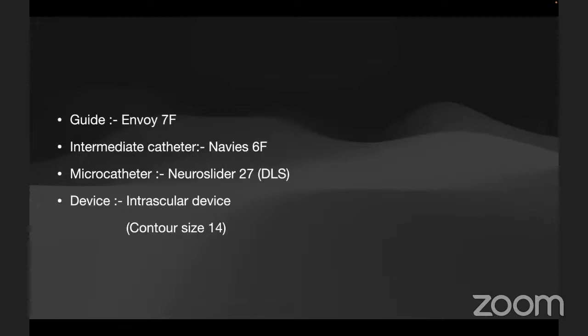With stent assisted coiling also, we may have to give antiplatelets throughout. Being a young patient, 30 years, we just wanted to avoid the antiplatelets at this very young age if it is avoidable. In that scenario, we felt Contour would be a better option, because we have to give antiplatelets only for a part of the time, not more than 6 months, as advised in the literature, so we went along with the Contour. So you placed only the Contour without any coils?